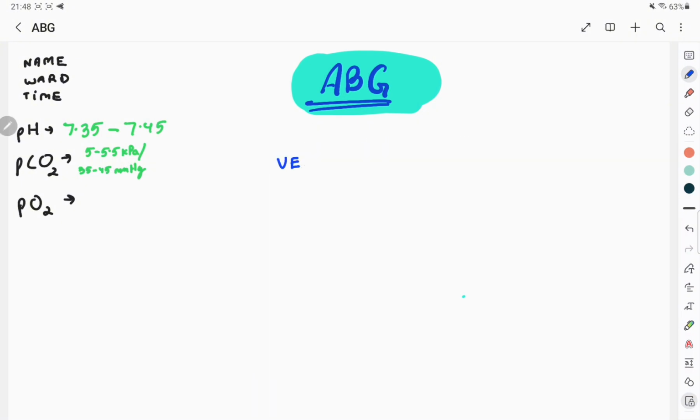Now, remember earlier when I said venous blood gases aren't useful for checking how well the lungs are oxygenating? That's absolutely true, but a venous PO2 has another secret superpower in the hospital. It is incredibly useful for confirming the correct placement of a central venous catheter.